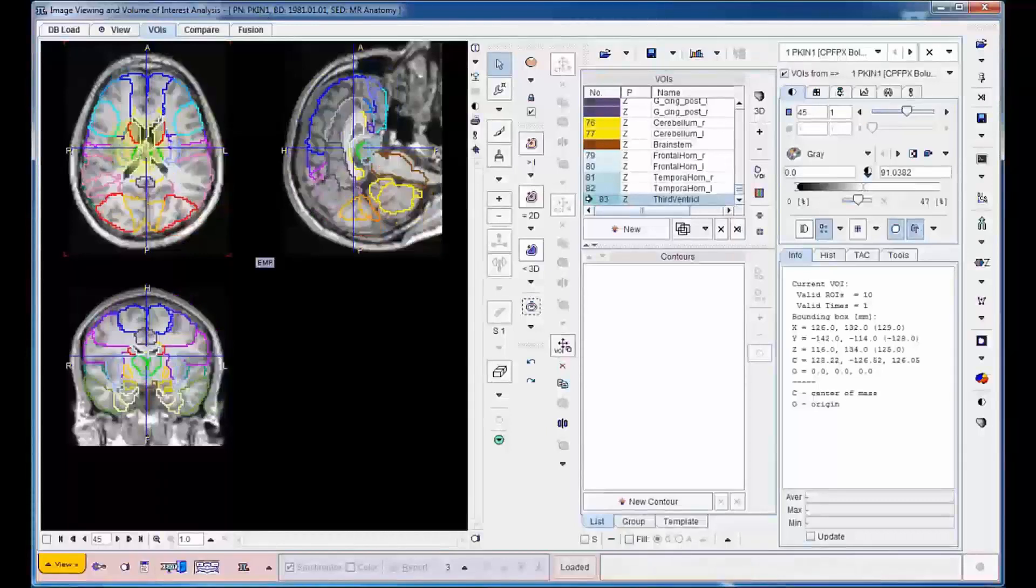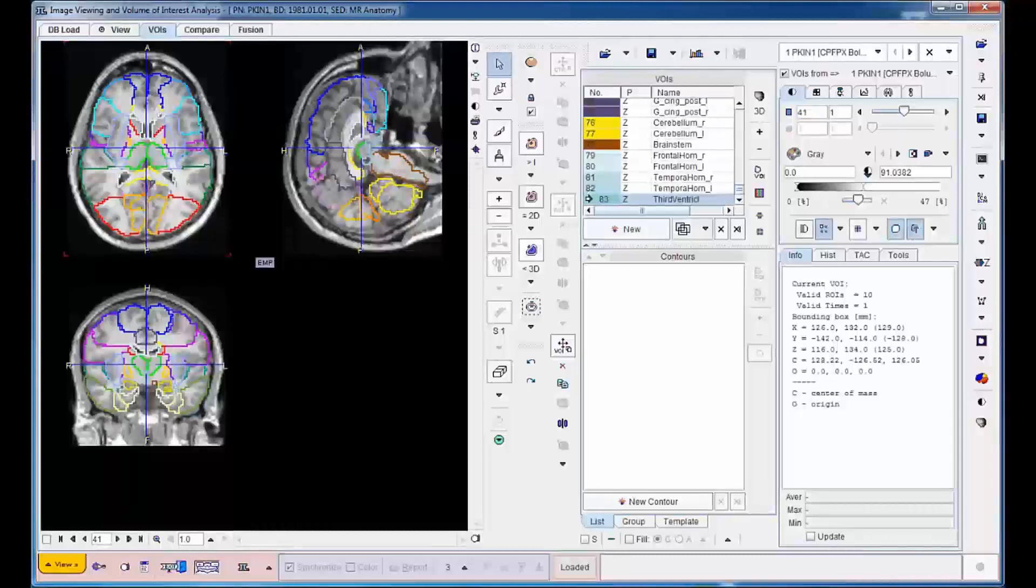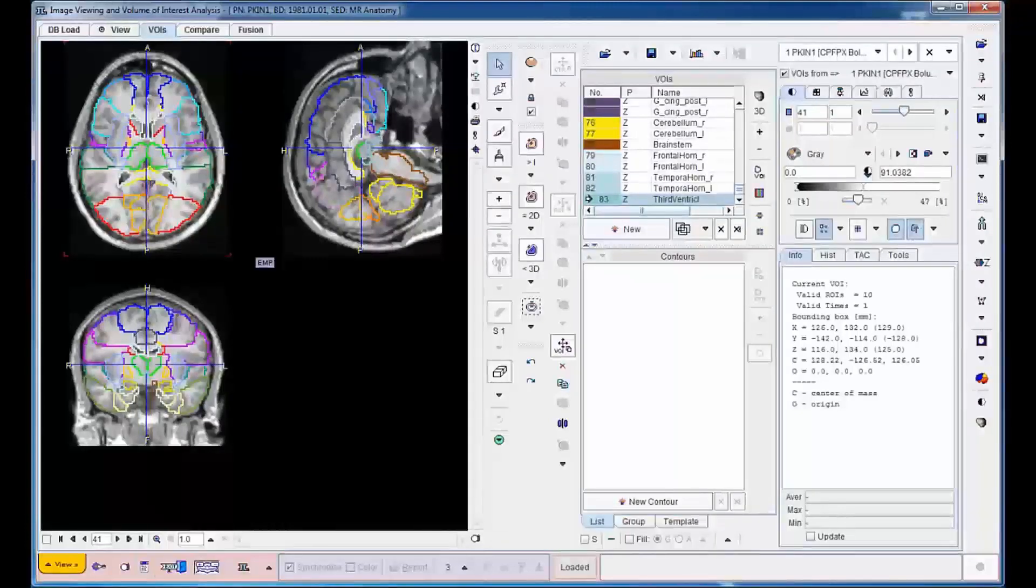The next step is propagation of the VOIs to the PET series. This is very simple with the example data, because the PET has already been matched to the MR in the PMOD Fusion tool.